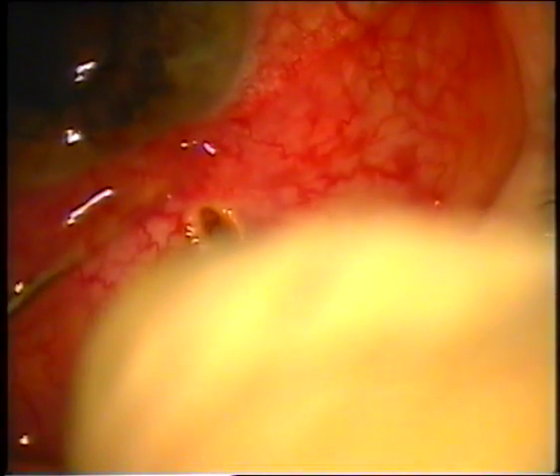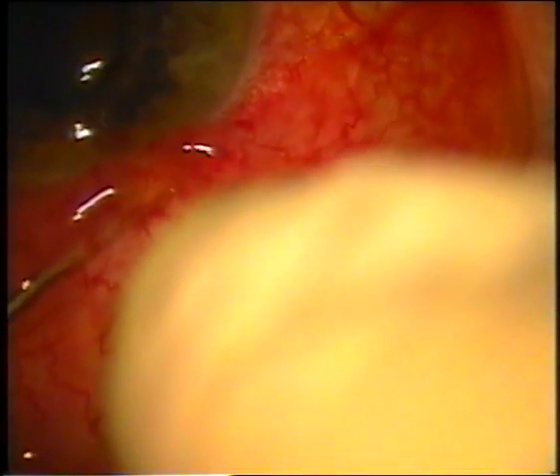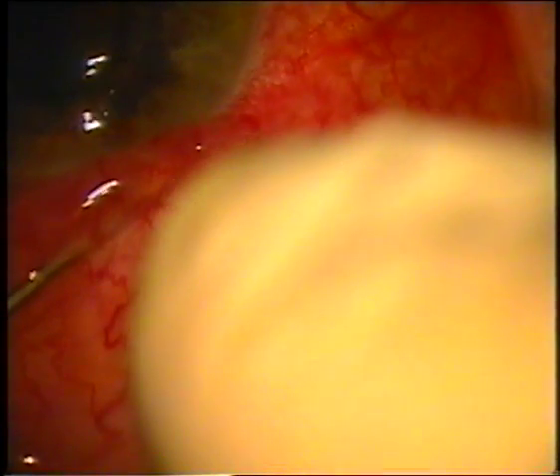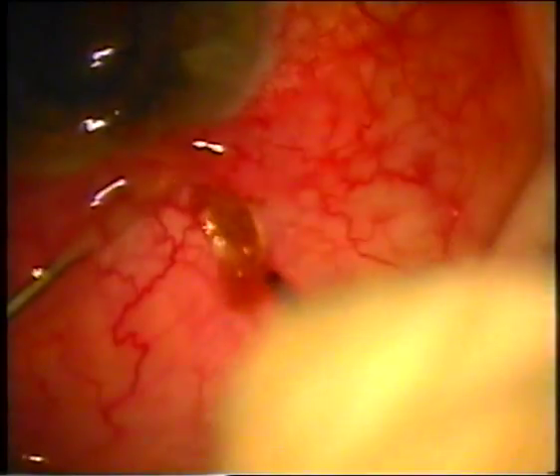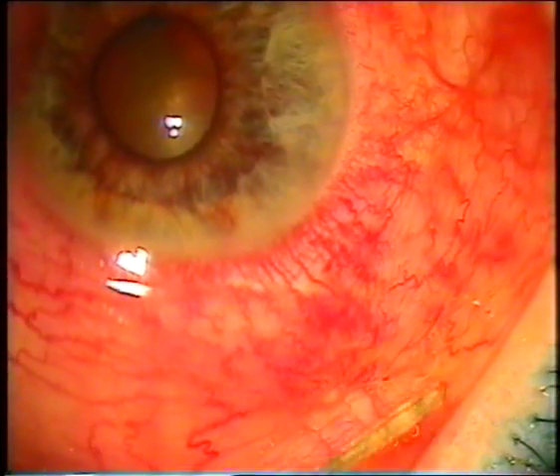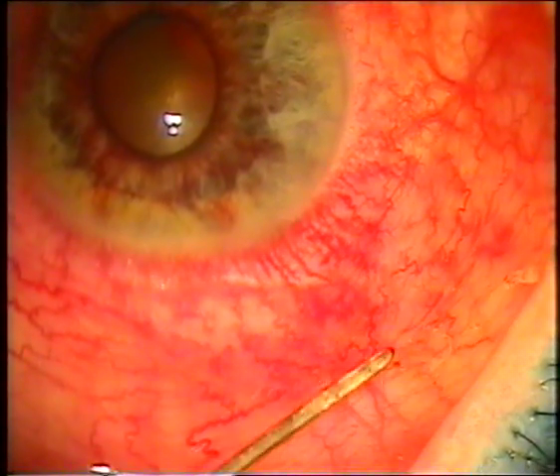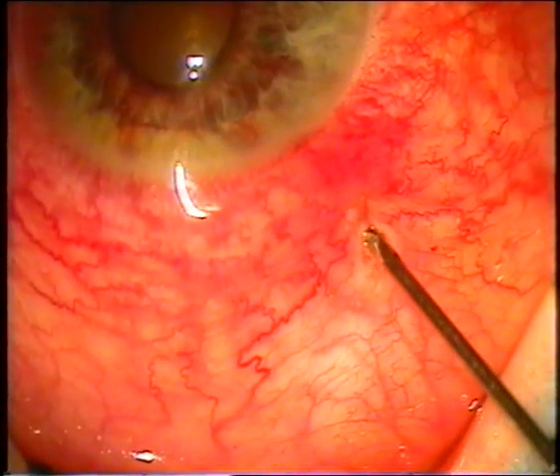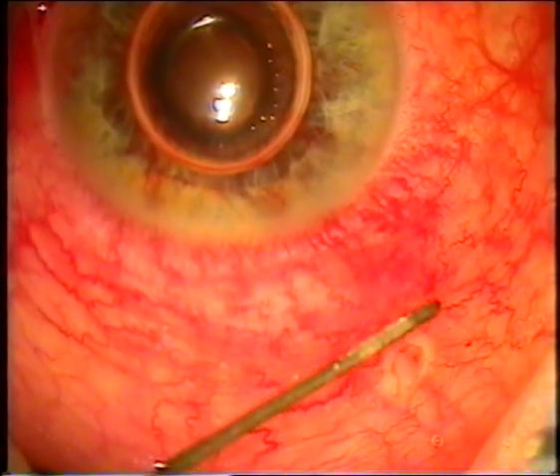We did sclerablation until we reached the ciliary body. We reached the ciliary body, as verified by the black spot, and entered into the posterior chamber. Fluid from the posterior chamber came in a gush, meaning we are draining the posterior chamber. To verify our position, we inject a bubble of air into the tunnel.